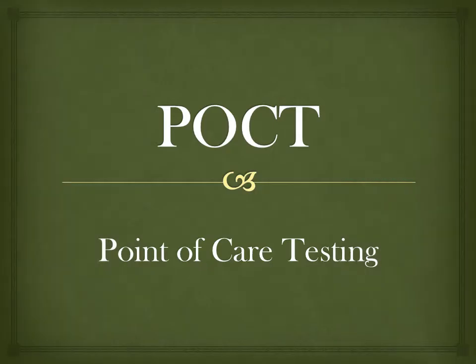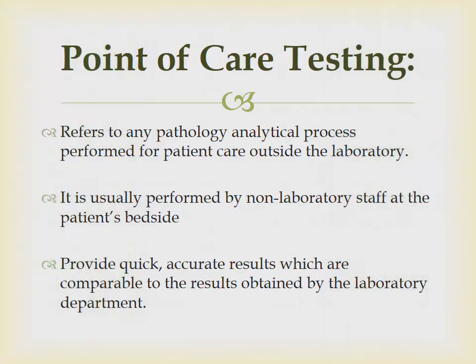Welcome to the Point of Care Testing lecture. Point of Care Testing refers to any pathology analytical process performed for patient care outside the laboratory. It is usually performed by non-laboratory staff at the patient's bedside. It provides quick, accurate results which are comparable to the results obtained by the laboratory department.